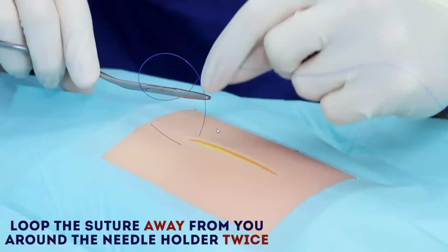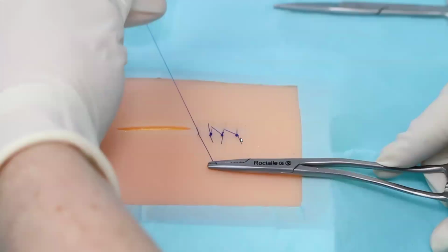Okay. The most important, half centimeter here, half centimeter here, then you can tie. You can hold the thread by your hand, no problem, but don't touch the needle. You will tie and put the tie on one edge.